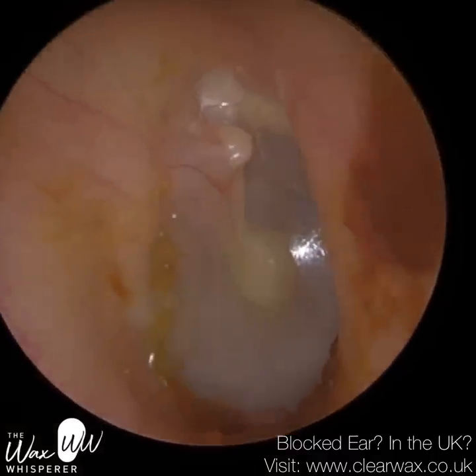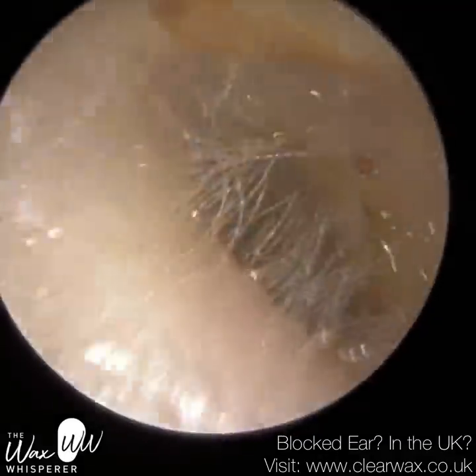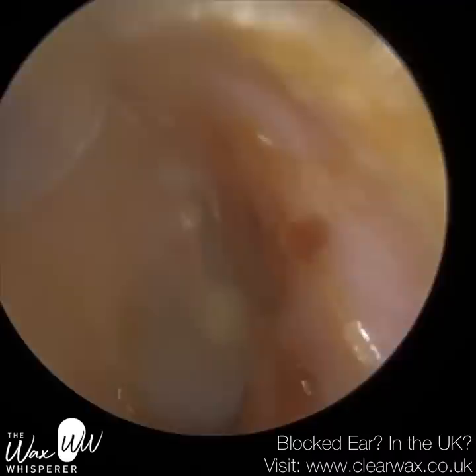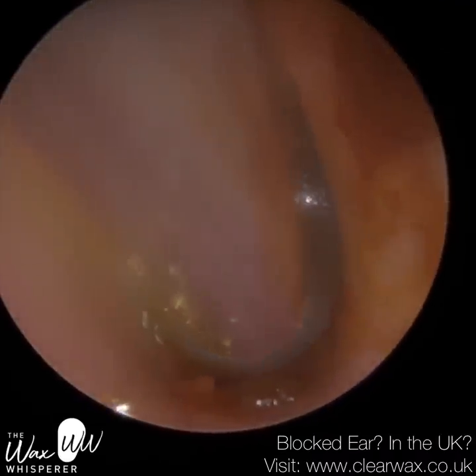You can see the eardrum — it's visible. Again, there's some wet material around the area. I was going to see if I can get this out. I'm not overly concerned if I can't — the patient can hear significantly better now. There was a bit at the end where the patient began to experience the caloric effects — they got a bit dizzy — so I came out of the ear and we left it at that.